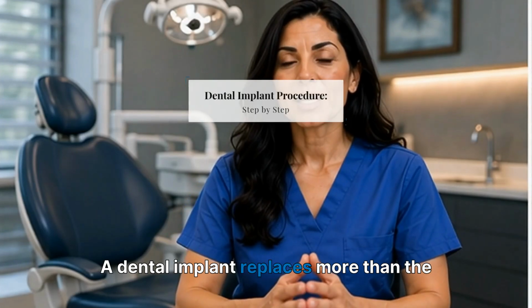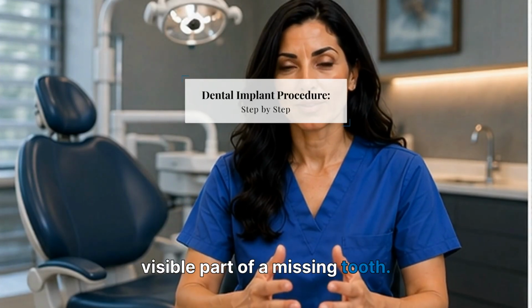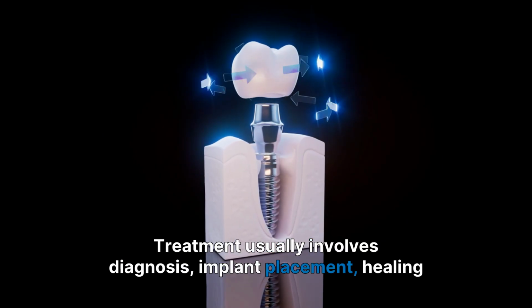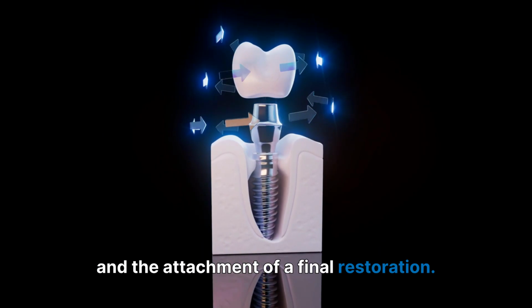A dental implant replaces more than the visible part of a missing tooth. Treatment usually involves diagnosis, implant placement, healing, and the attachment of a final restoration.